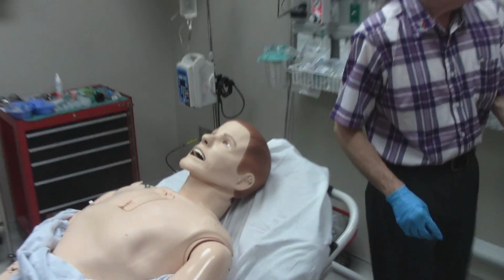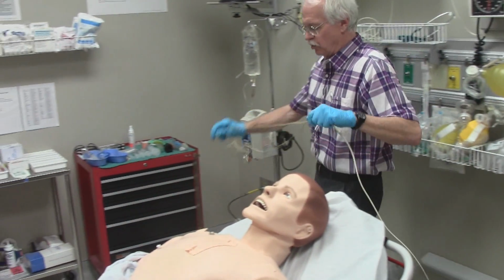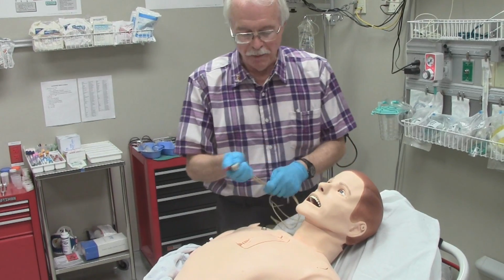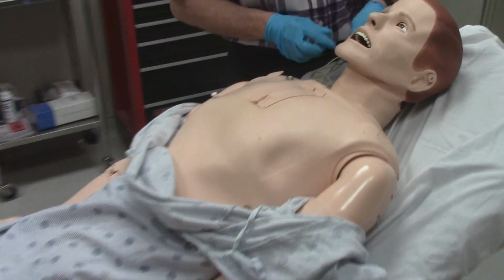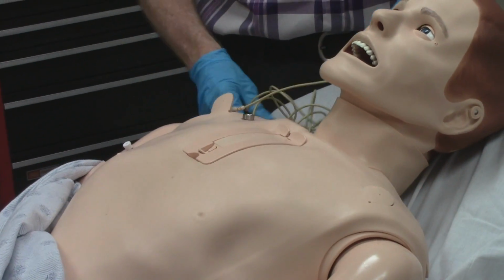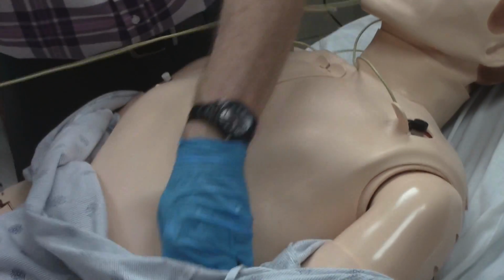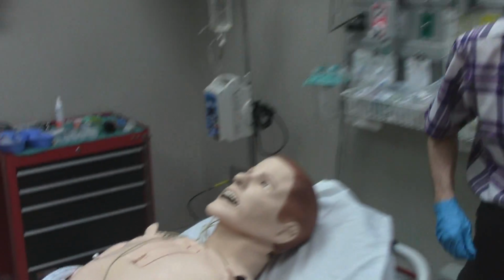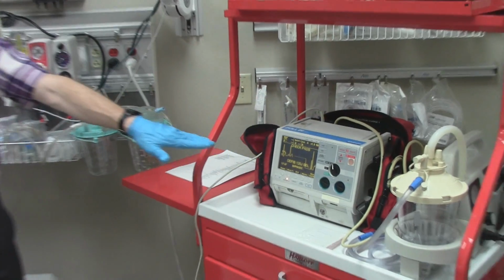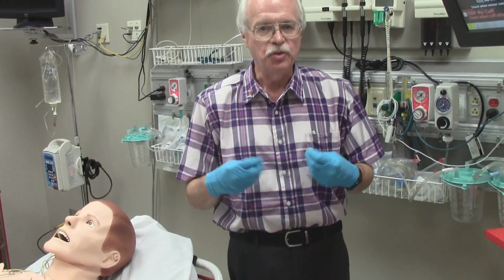To attach the patient to an ECG monitor, you don't need electrodes. This is true of all of the Laerdal monitors or mannequins. On the patient's chest, you'll notice we have metal posts. The ECG leads simply snap down onto those posts. And once they're in place, and we've selected an appropriate lead from the cardiac monitor, we see the electrocardiogram. So again, just snap the leads directly onto the posts on the patient's chest. You do not need electrodes.